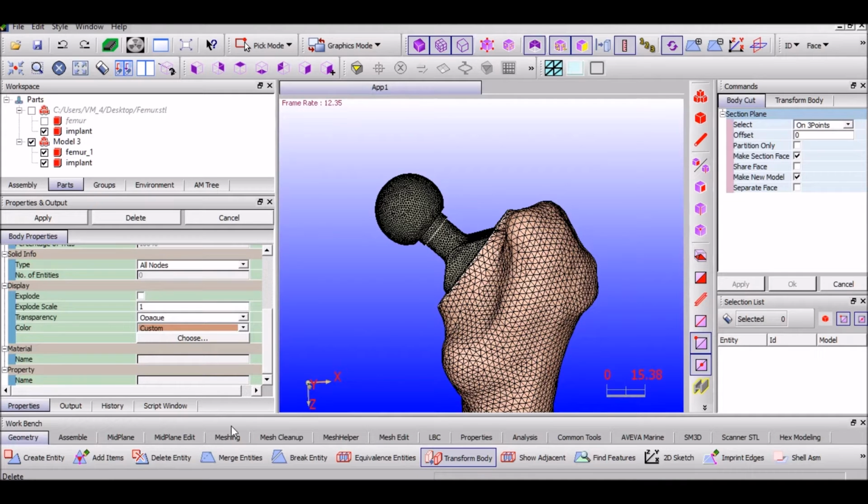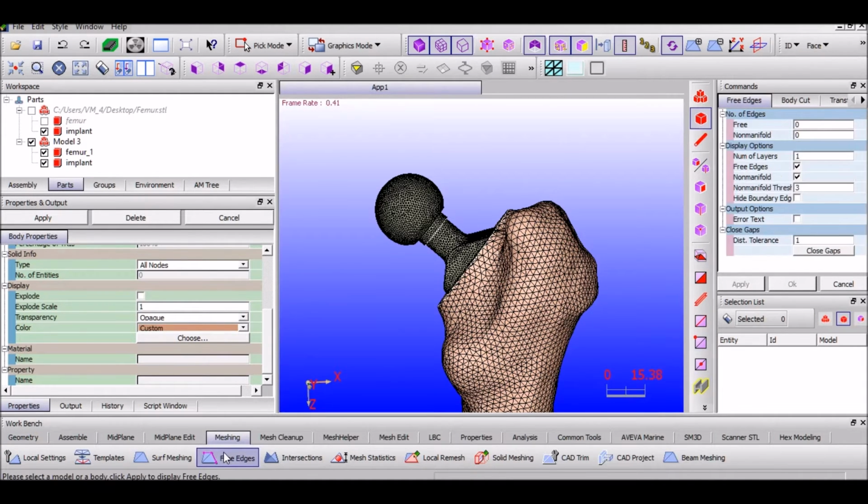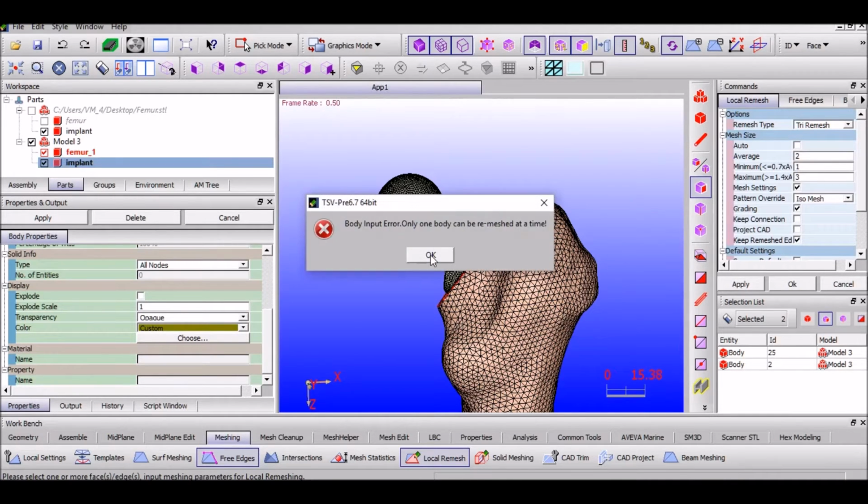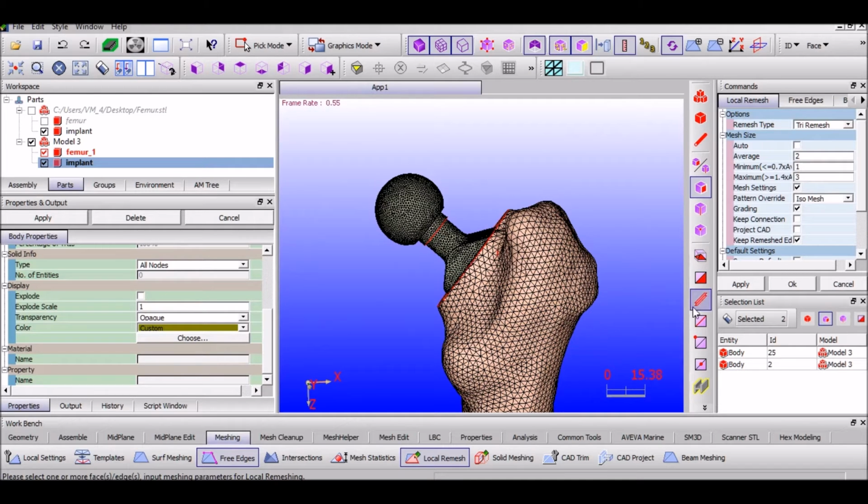The next step is to remesh the body. So go to meshing, select local remesh, select the mesh type as tri remesh, and change the parameters of the mesh according to your preference. Make sure that both the mesh and the implant have the same tri remesh size. You can only select one body at once, so please complete the remeshing individually.